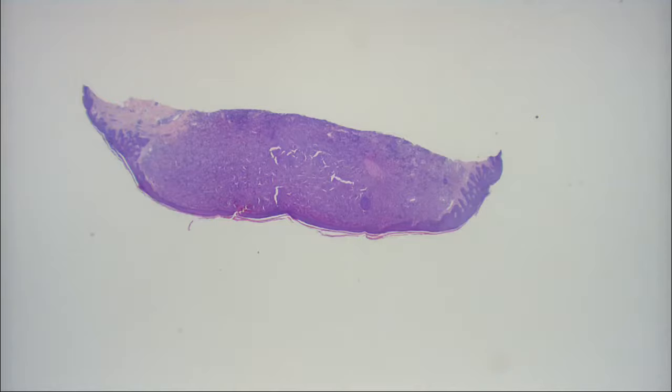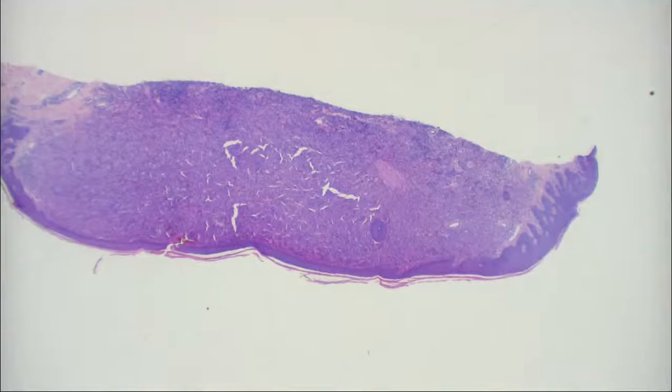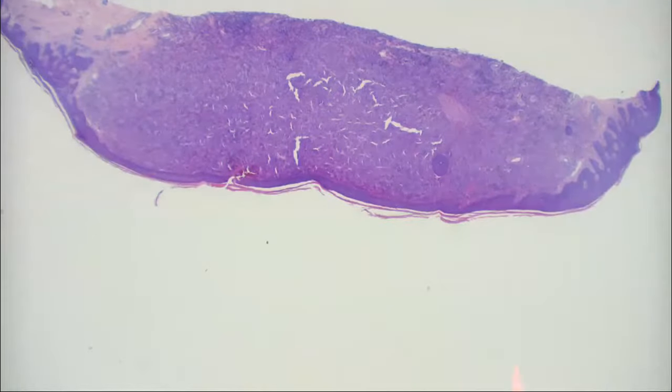All right, well, let's move on to this one. Okay, so this was a shave biopsy, and there was a sea of these cells in the dermis. I thought the overlying epidermis was okay. Initially I thought this was going to be a lymphoma because it was so dense, or metastatic disease or something like that.